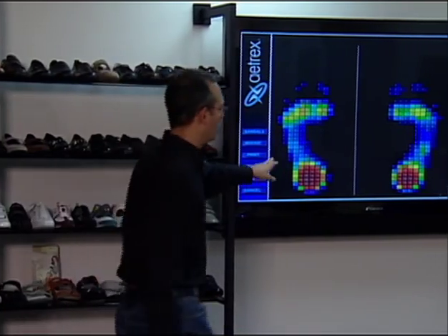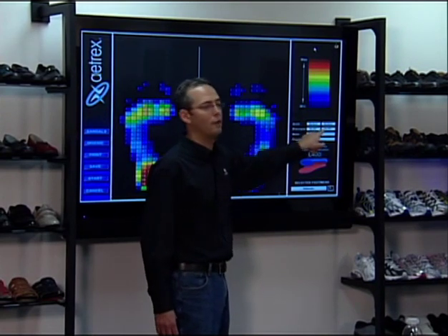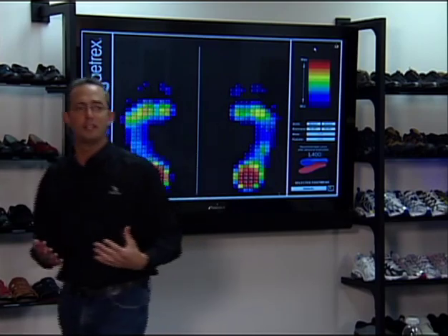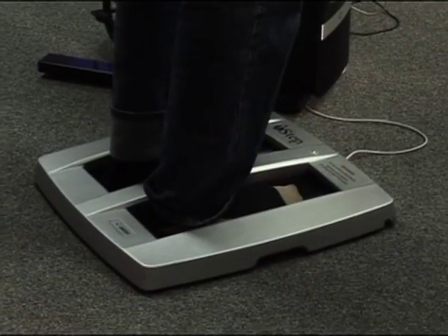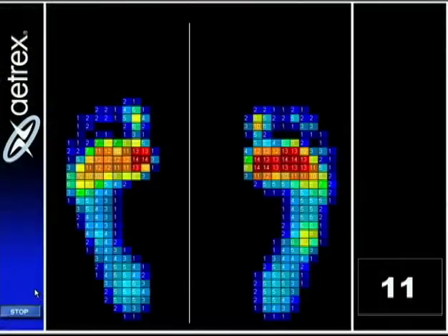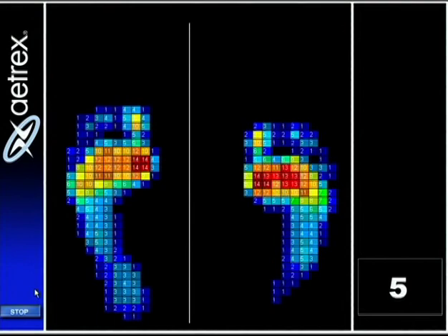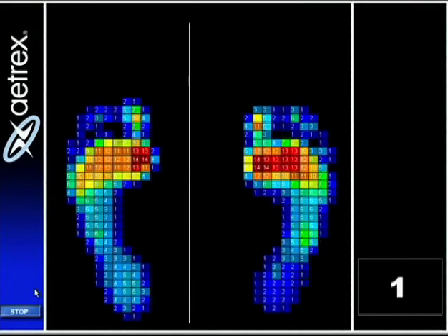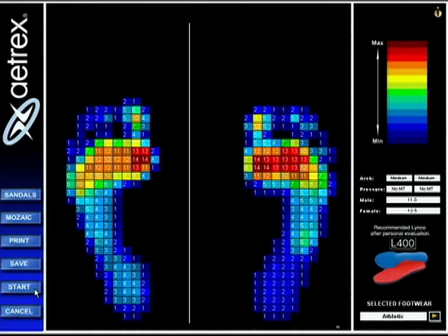If you look on the right-hand side, it says arch, pressure, male, female for sizing — and no met, no met — meaning that for both feet, it's recommending not having a metatarsal pad. I'm going to stand on this machine and lean forward to try to generate a lot of pressure in the forefoot, just to show how it works. We got 3 in a row for 14, so I still won't qualify for a metatarsal pad. It says no met, no met.